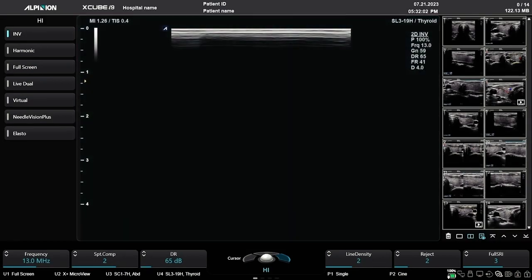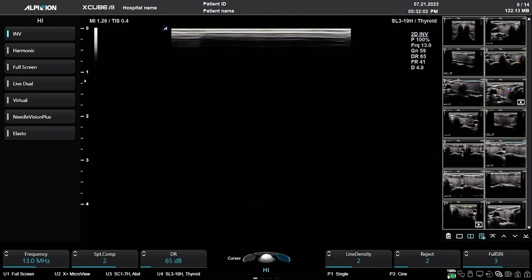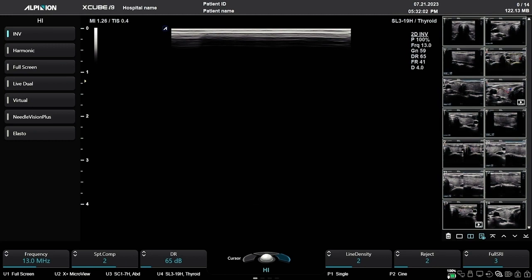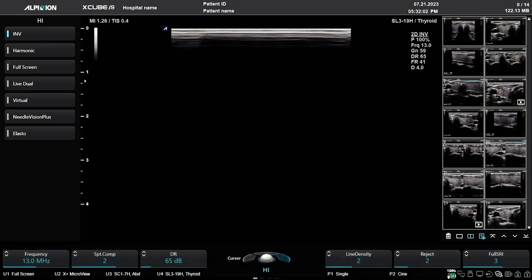3. The central monitor area is the image area, imaging parameters, gray color bar, and focal number and position. 4. Right column is the image clipboard where the saved images and cines are in view. 5. Across the lower monitor is the soft menu and trackball controls and status.